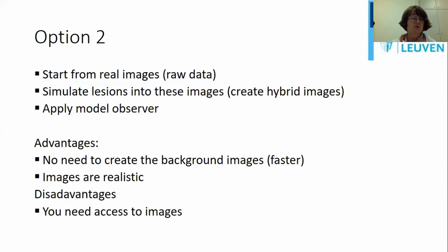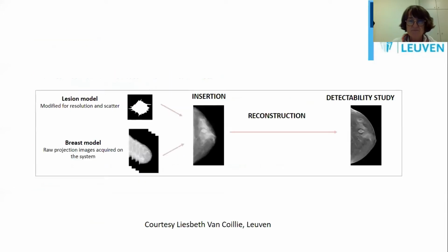Advantages are trivial. There is no need to create the background images to really create the whole patient. We would have to create the lesions, of course, to merge them with the images, but there is no need to create the background images. These images are really easily realistic if you do it correctly. And there is obviously a disadvantage, which is you need these images. So you cannot just do it without having access to images.